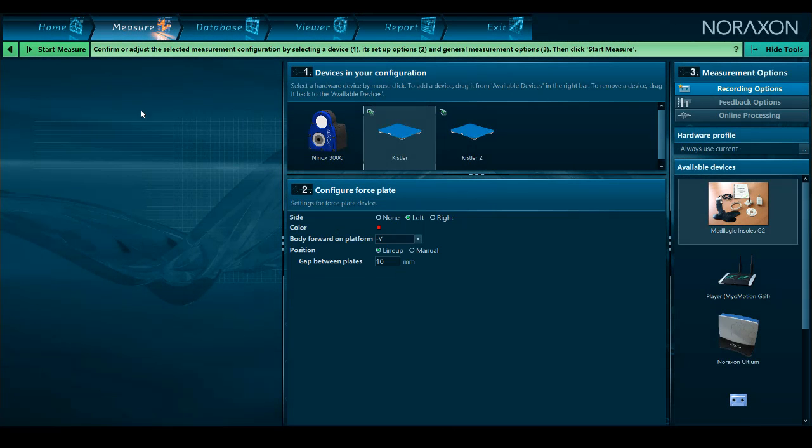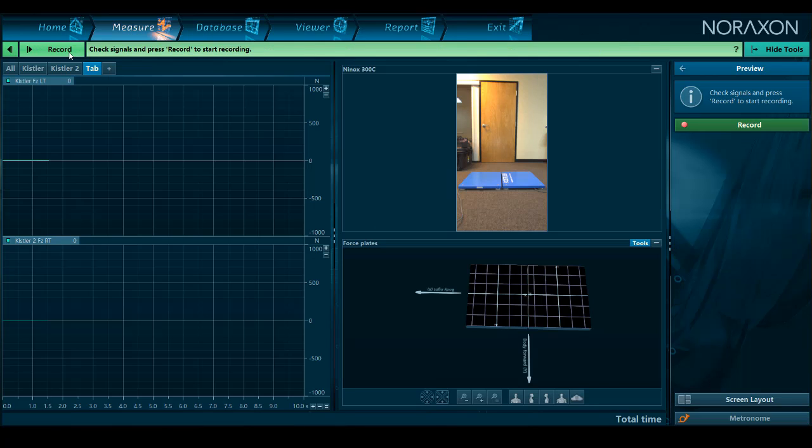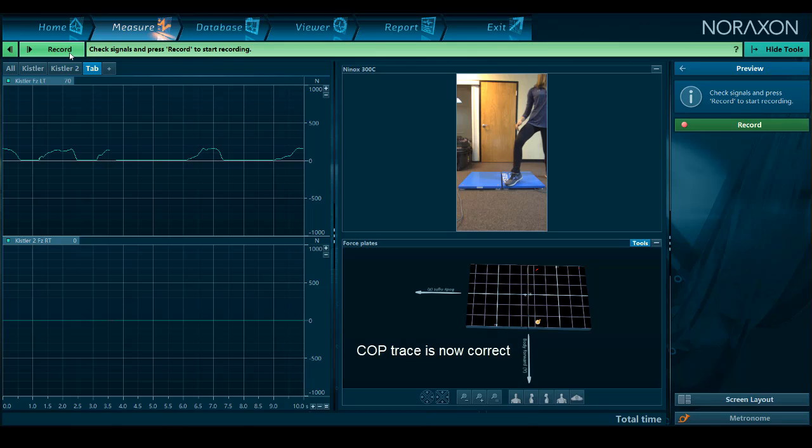After changing the body orientation from the configuration, enter the measurement window again to check the accuracy. You should only need to set up the COP tracing once for a configuration, unless you intend to move the force plates to a different location. You can use the same directions and values.